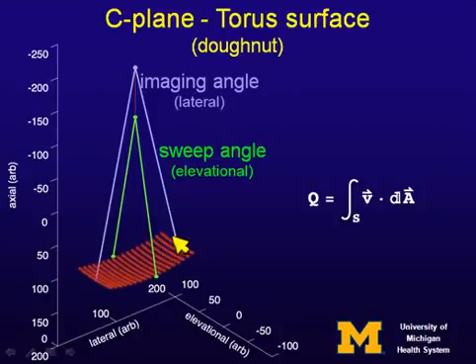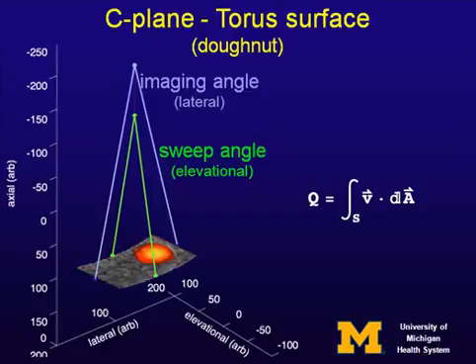And it turns out that the easiest surface to use is a curve, a section of a torus, or not a plane, but that's a detail in the technique. The technique works just fine with planes or curves. What you end up with then is a cross-section of the vessel which corresponds to the C-scan. And the C-scan is where the money is. That's why you need 3D.